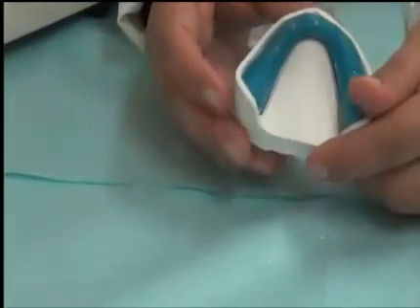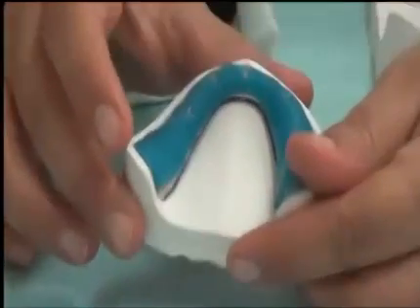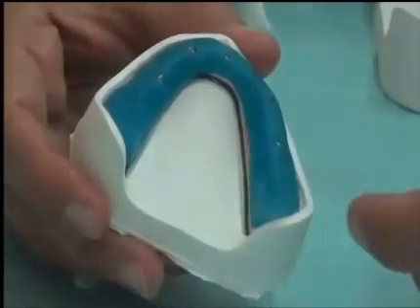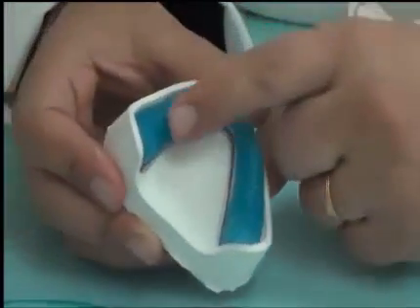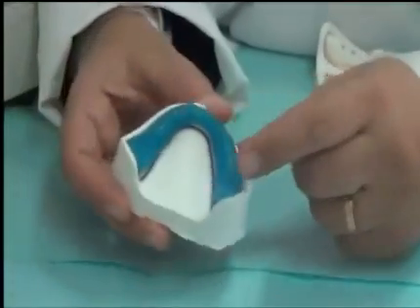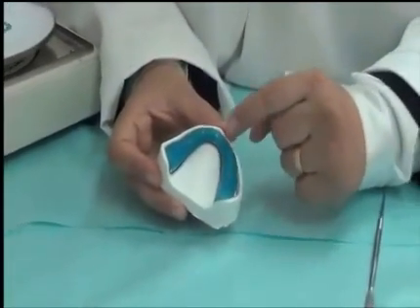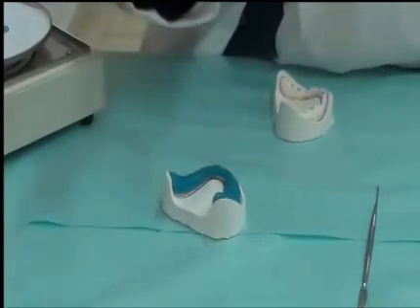It becomes easier. So if you had cured it and it becomes solid and you want to place perforations, you simply come in with the bur and trim them. But it's easier for you to make these holes in the light cured material while it's soft and then cure it. And this leaves us with the tray body ready, and then we add in the handle with some excess of light cured material.